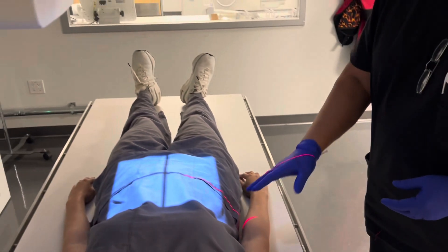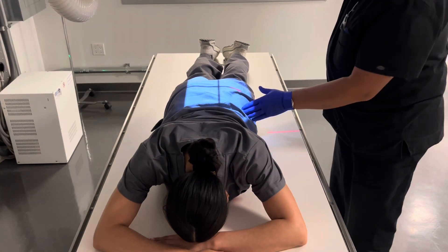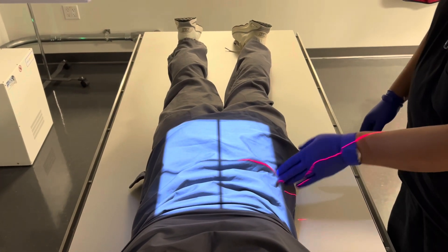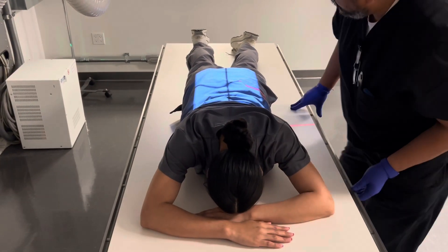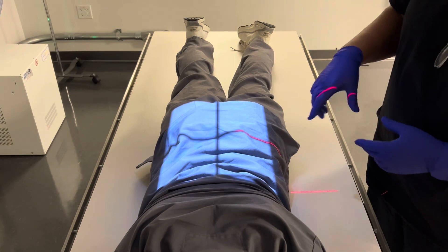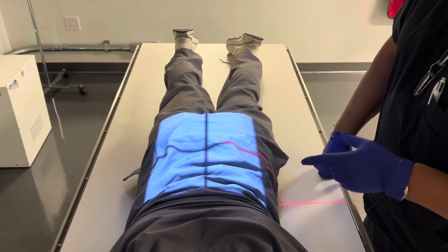Now for the PA, we're going to have you turn over and face down. Insert the receptor and center again at the iliac crest on the mid-sagittal plane — 14 by 17, 43 by 35 centimeters. Make sure the hips are equal distance. In the PA position, the transverse colon and the rectosigmoid region will be filled with contrast material.